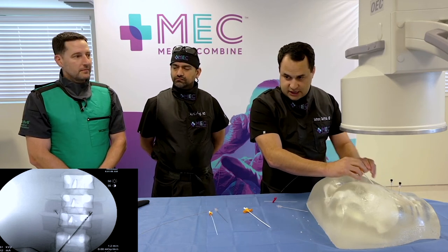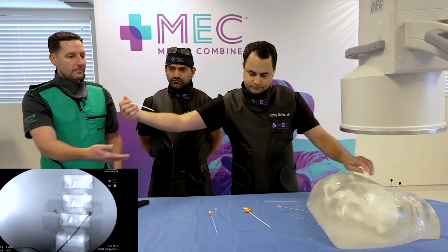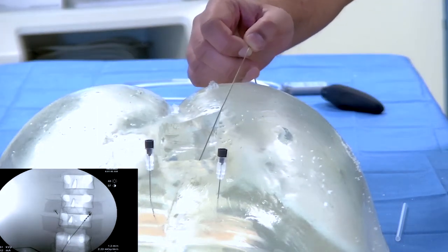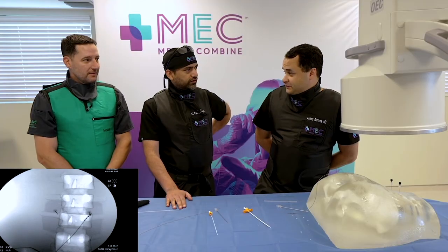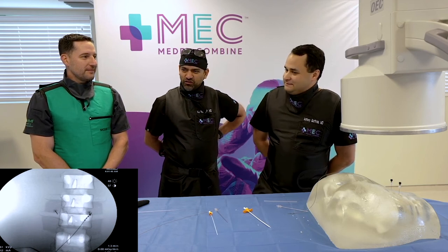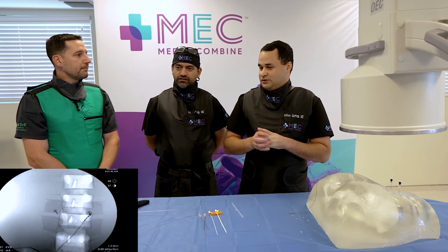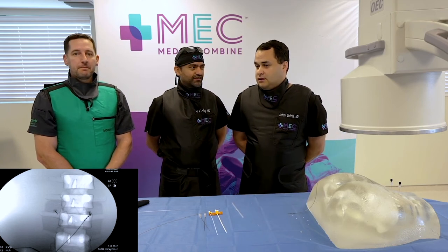Go slow when removing — you don't want to pull on it too much. The inner stylet will come out with it as well. Now we do our push-pull test — you can actually see it wiggling back and forth in that muscle. Those tines do a pretty good job of staying in there. Migration was my first question — with PNS you sometimes get post-op imaging where leads have moved. In the 204-patient ReActivate AP trial, there was not a single lead migration. Commercially, we are far below 1% as well.